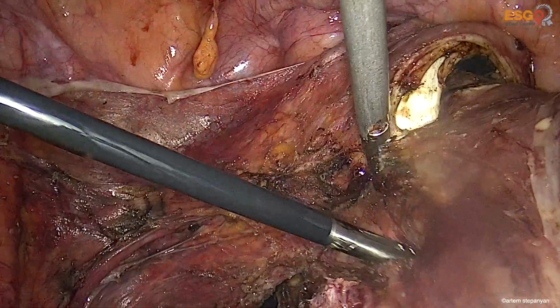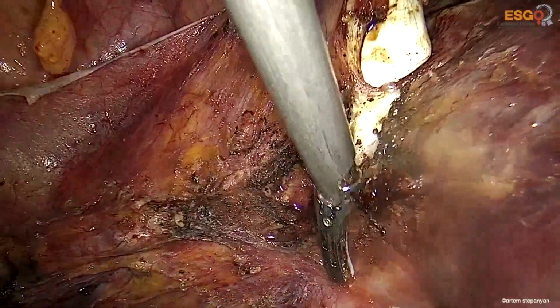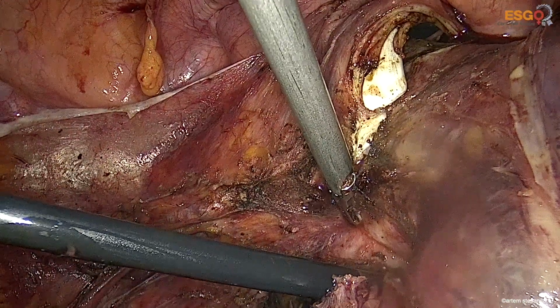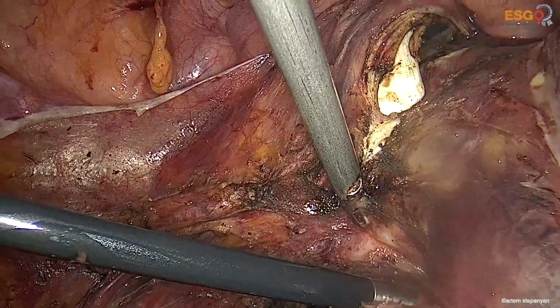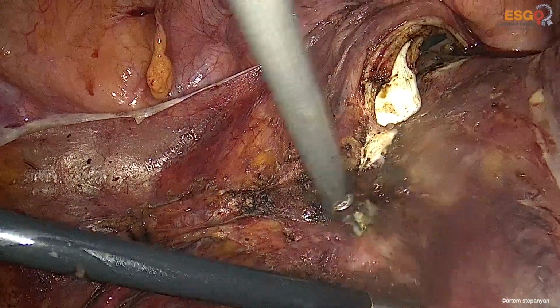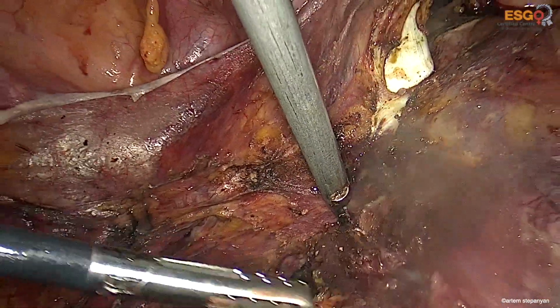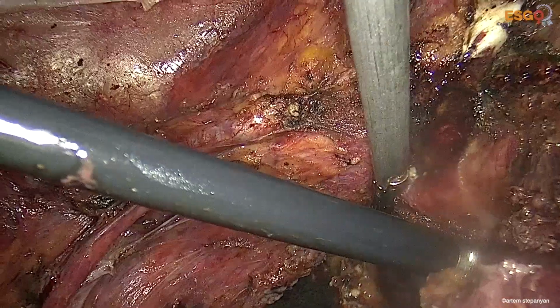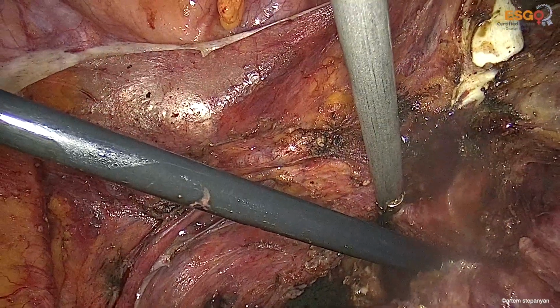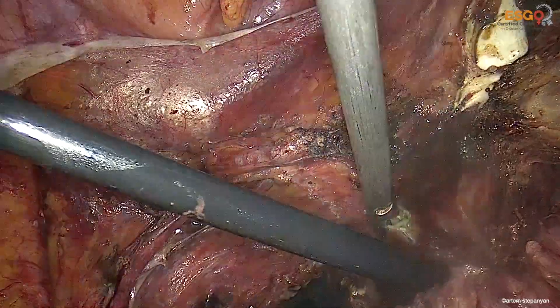And then we gradually and circumferentially cut the vagina, having the whole tumor and the posterior pelvic peritoneum in one block. Which is the goal of the Hudson's hysterectomy.